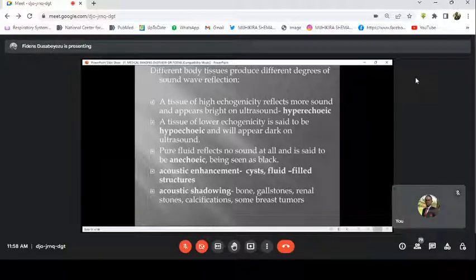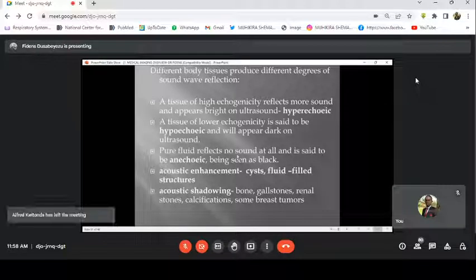So, listen, let me continue. Pure fluid: I told you that fluid is a friend of ultrasound. Pure fluid reflects no sound at all, and is said to be anechoic.